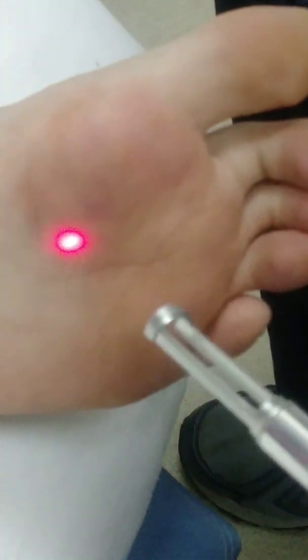We're doing a brief video on the Q-Clear laser for the treatment of plantar warts. This is the third treatment we've done on these. They're much, much smaller.